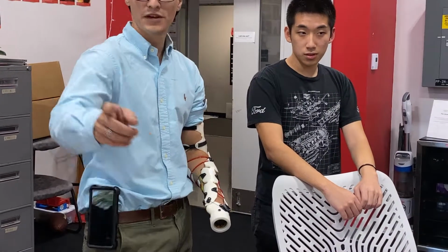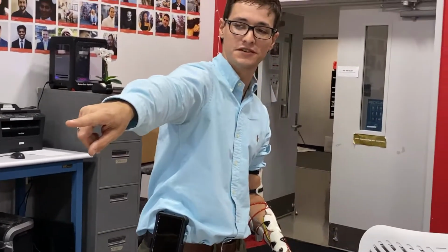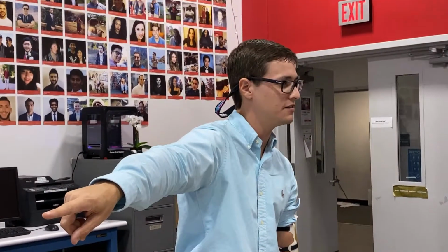And then we have some pieces. I'm sorry, I put them all the way at the end of the table. If you guys want to pass around the printed nylon, is it the nylon and then the PCTPE? Mm-hmm. That's just the flexible materials.